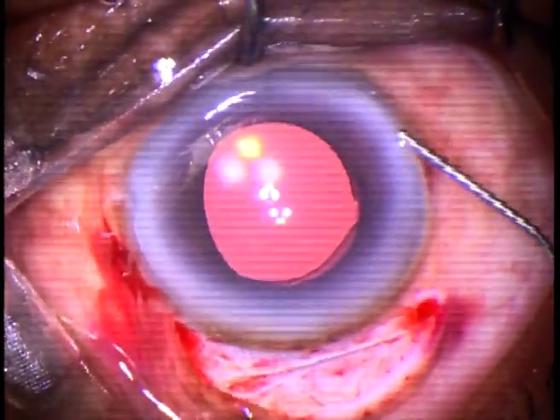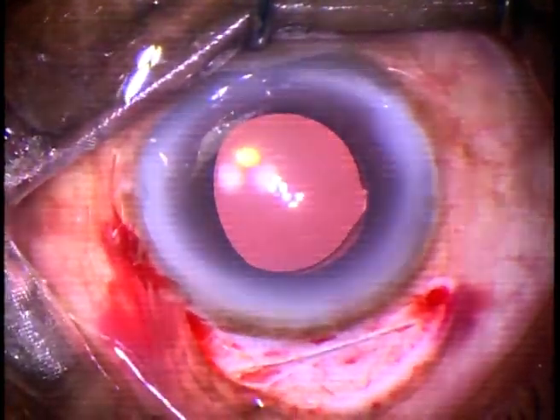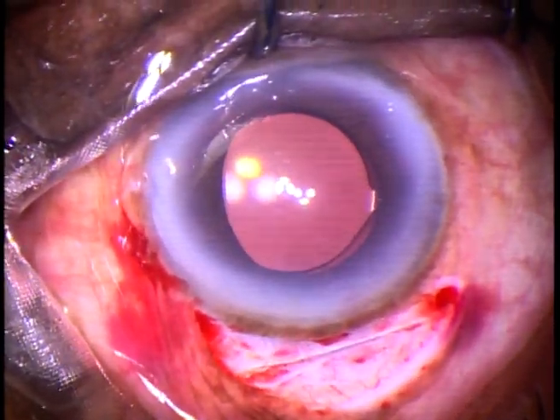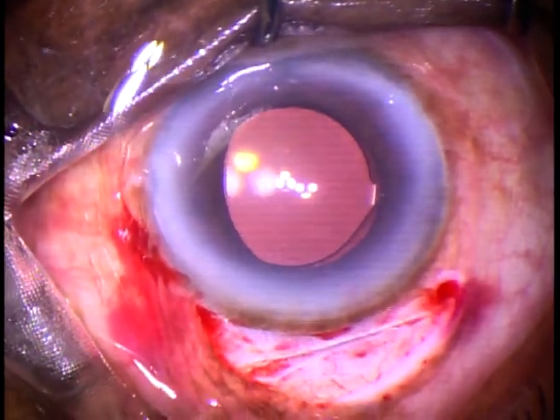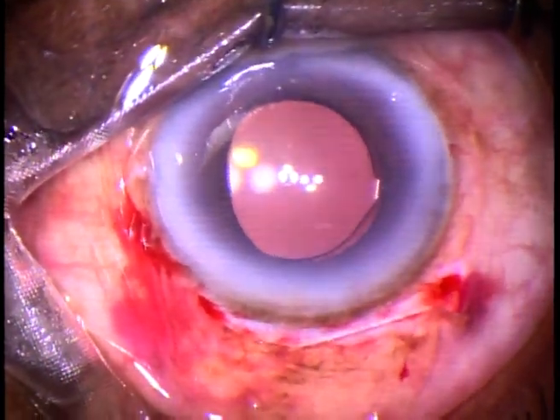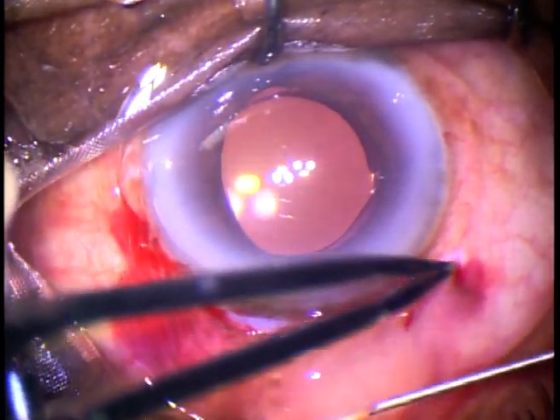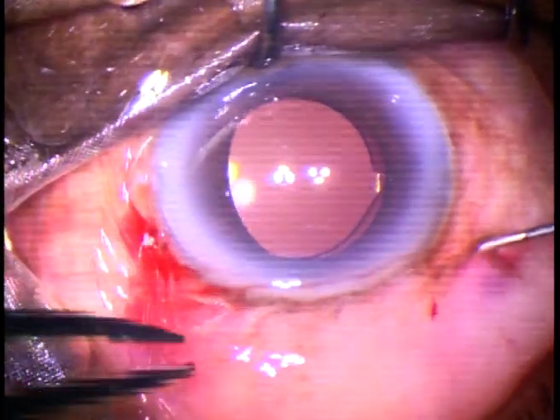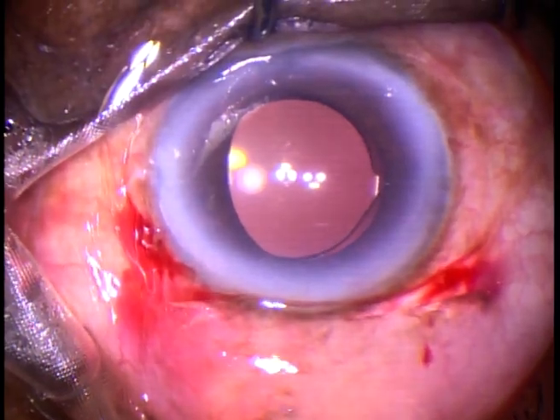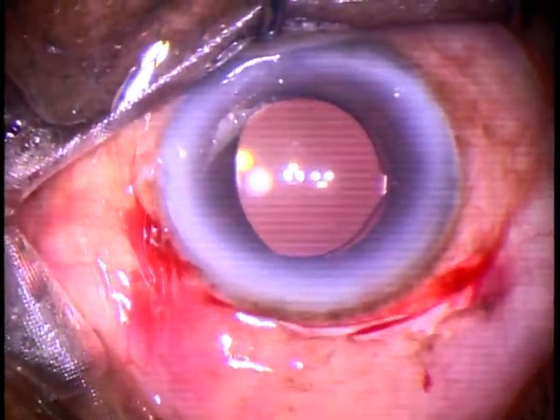This is a bit of moxifloxacin. Feel the intraocular pressure again and it is fine. And now, how to oppose the conjunctiva to the limbus? I use two ways — one is sub-conjunctival injection, and sometimes I use a releasable suture. If we just keep this sub-conjunctival injection of gentamicin and dexamethasone, the conjunctiva comes forward and gets opposed to its original position.